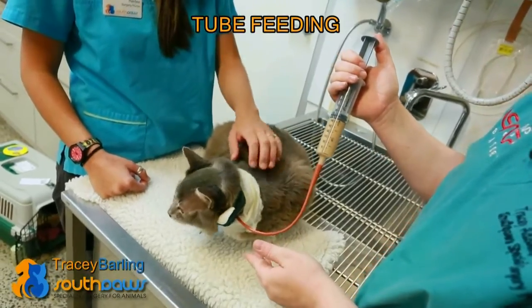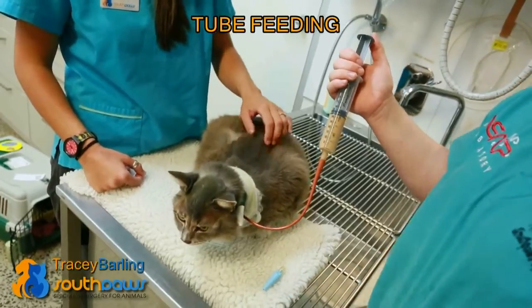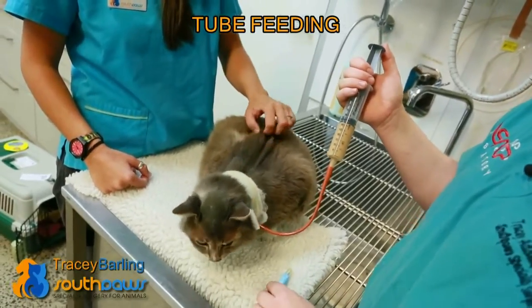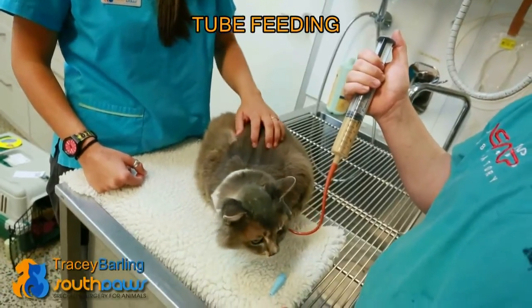When you do a feeding plan, we usually start them at day one, which is only a third of the amount that they require per day, and you do that over six feeds a day. On the second day you change it to two-thirds of the amount, and day three is the full amount.